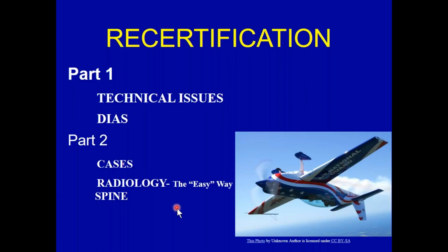The key word for that part of the presentation, the first 2 hours, was the word collimation. Then we introduced and talked about digital imaging acquisition systems. Some of you have those, whether it's the cassette-based system or whether it's the point-and-shoot DR system. And we said that certain things were basic and important, whether it was conventional X-ray or digital X-ray, one of those being collimation again.